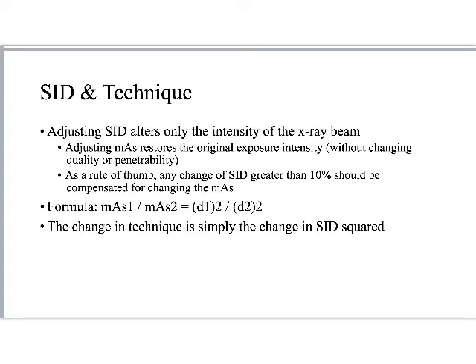So, let's switch gears. We all know that. That's an established fact. How do we deal with it as technologists? What does this mean for my technique? Now I need to start thinking about the inverse square law because I'm trying to compensate for this, right? I'm trying, as simply as I can put it, to compensate for what I know about the falloff in volume or intensity.